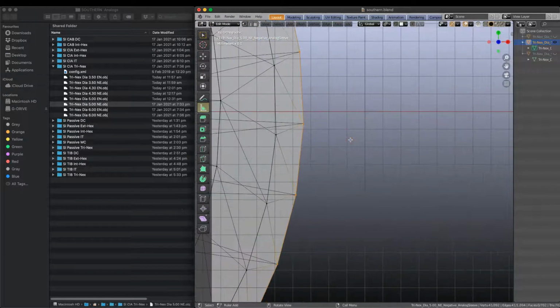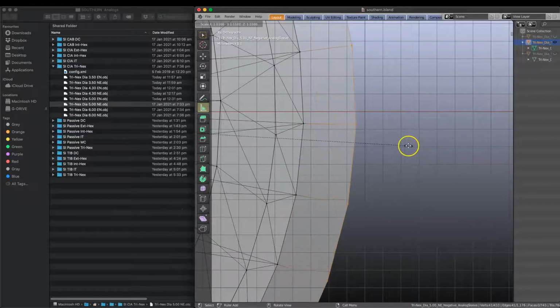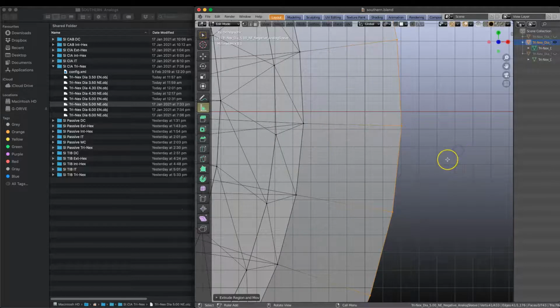Now it is important to take note of the following keystrokes. So we want to extrude this edge loop outwards and we want to size it outwards. So we're going to be pressing E followed by the letter S for size. E, extrude, S. Now we're going to count to 5.5. 1, 2, 3, 4, 5.5. Okay, set it down here, left click.